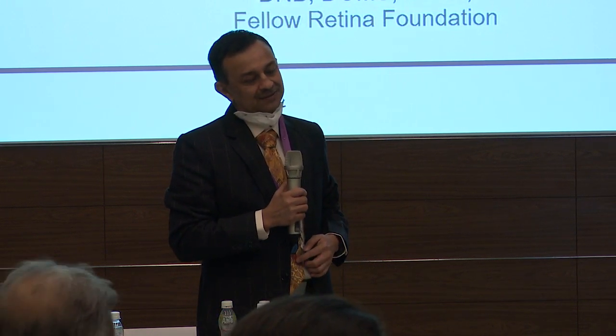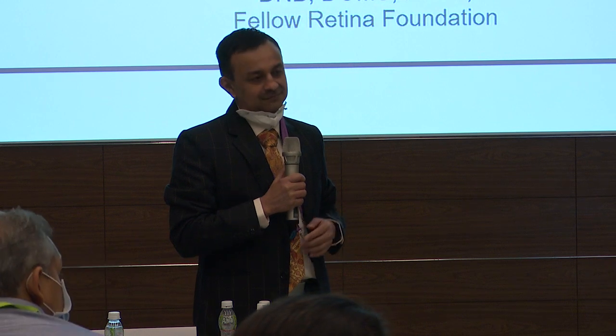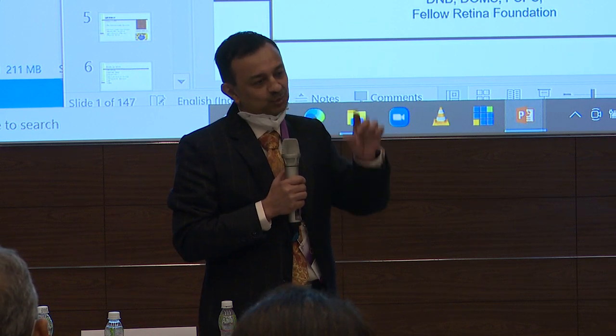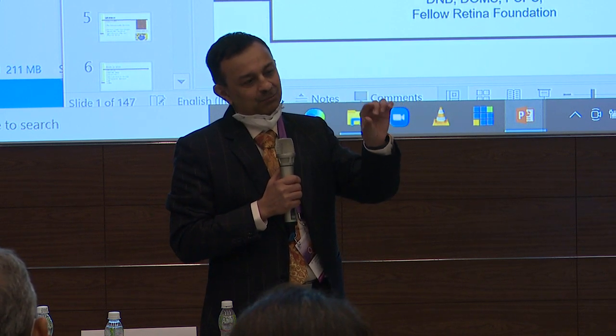What happens on follow-up, like once VKH resolves? Do those changes disappear completely, or does the RPE become more atrophic? The bullae flatten down, but they become thinner. This is just a 1.5 to 2 years follow-up with us. We are trying to understand what this information is going to guide us, and whether it can really be put into clinical use.